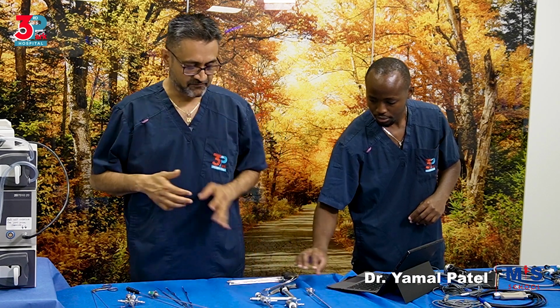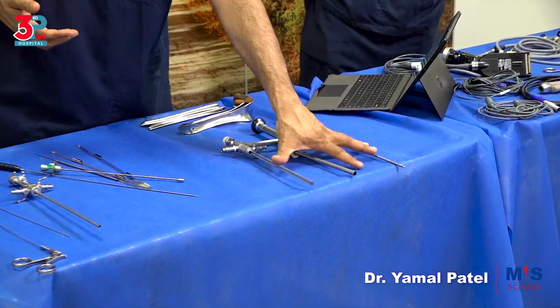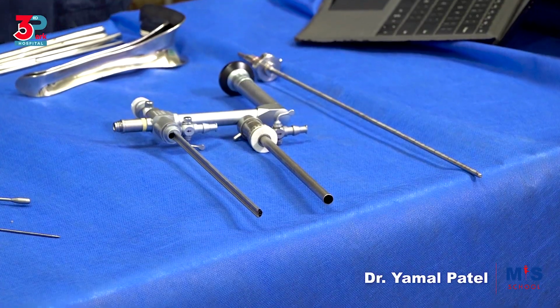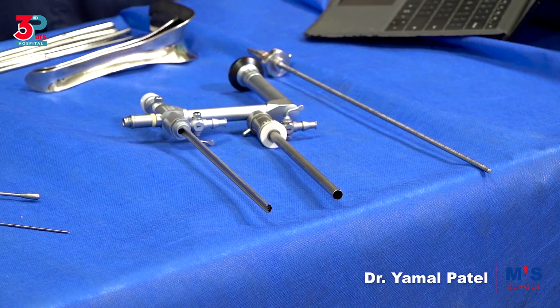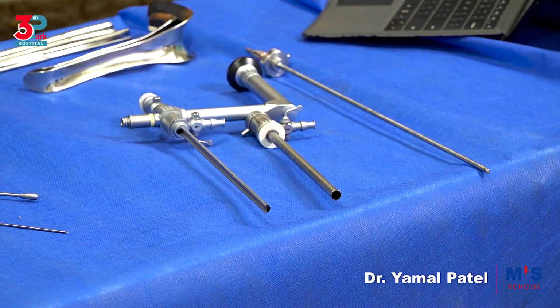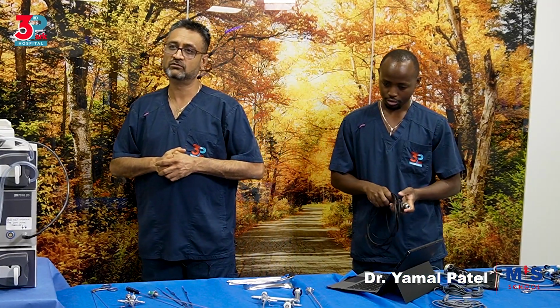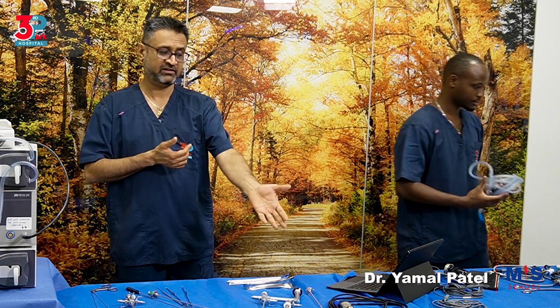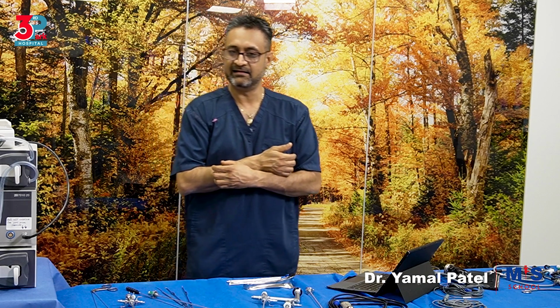So this circumvents that problem, and you have, this is the IBS, which is the Integrated Bigatti Shaver from Karl Storz, and we have a similar tissue removal system, the TruClear tissue removal system from Medtronic. They work on similar principles. There is another one that is also called MyoSure from Hologic. So this is one. Having this here at this point, I'm going to demonstrate on this one. You will be shown the TruClear system there on site.